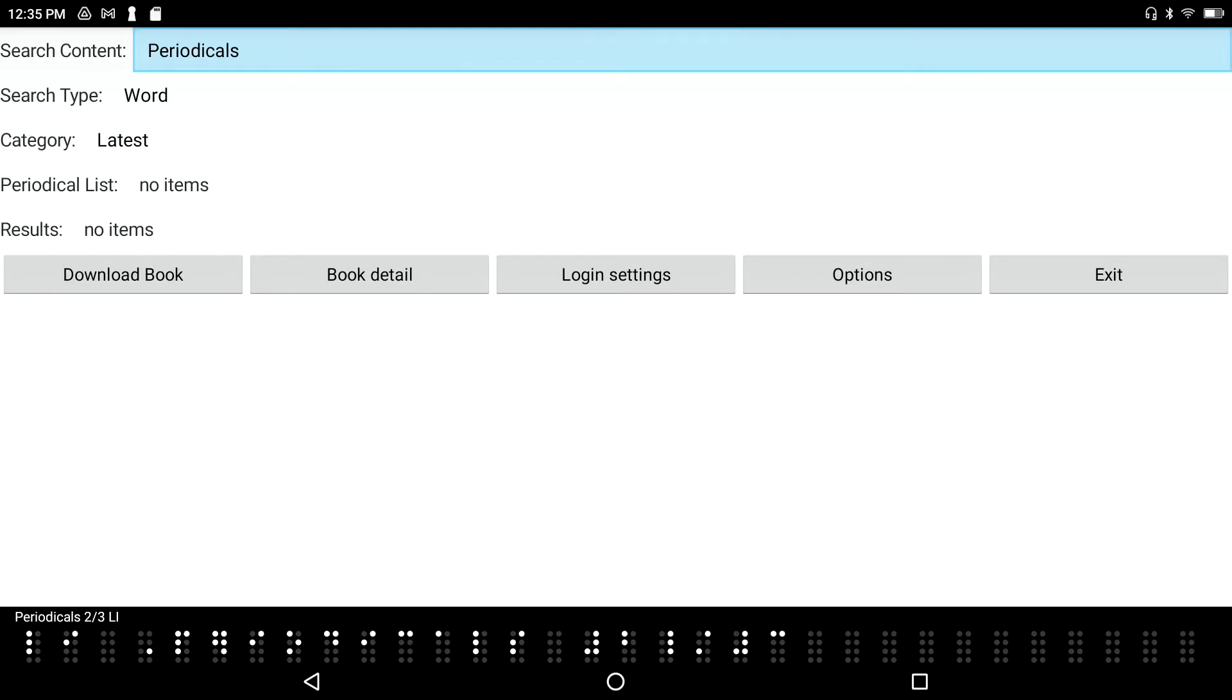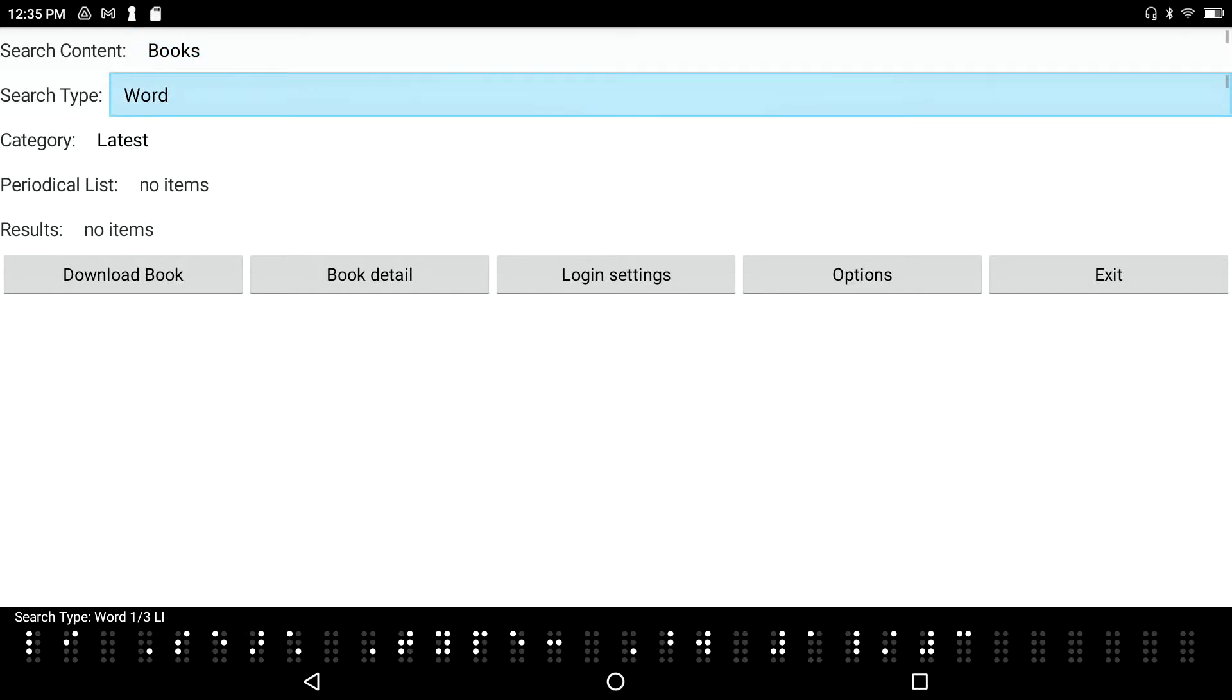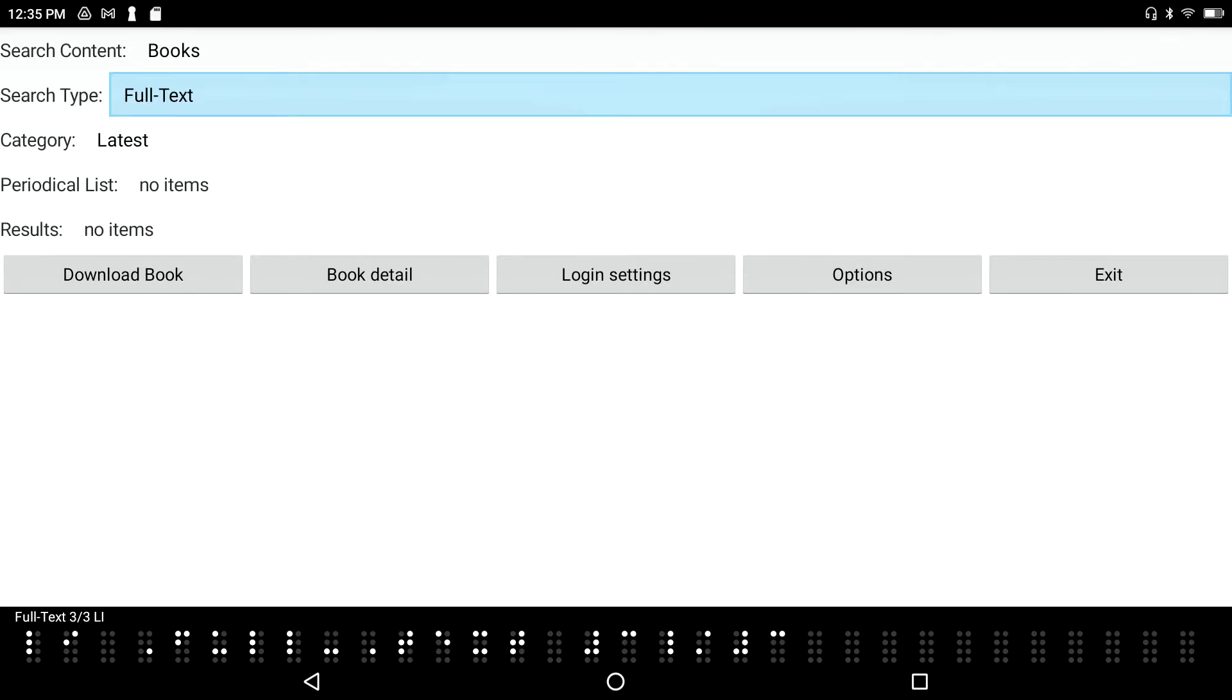My choices here are category, full text, or word. I'm going to go back up to word. Tab again: title, author or ISBN edit box. This is where I would type in my title or my author.